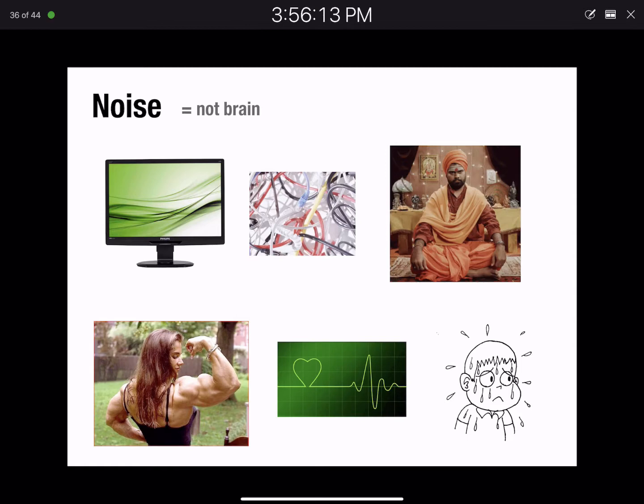data. They're not so much of an issue because, again, we're recording lots of trials, averaging them together, and those EKG signals aren't going to be time-locked to your signal or to your stimuli, and so they're going to basically just average out over time. Some of the other sources of noise are worse just because that signal is very quick and transient, and occurs at different points in time.